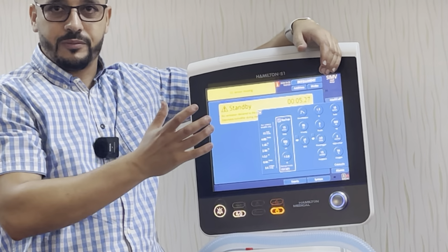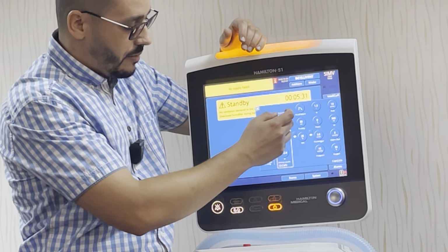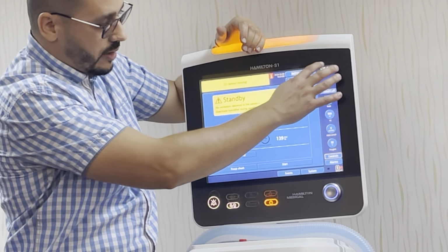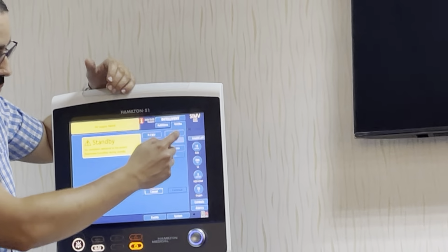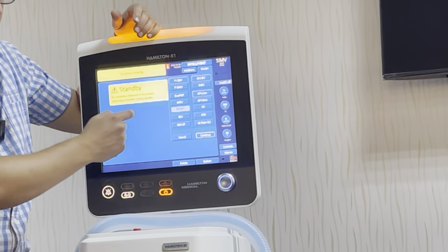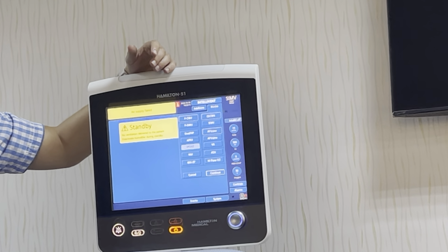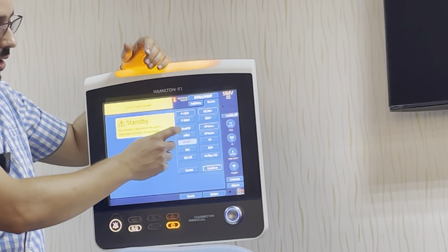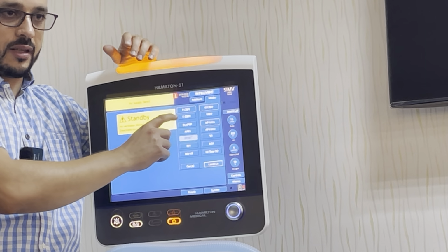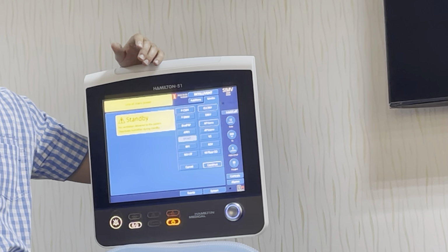اسماء المود يضيعوا. هذاك علاش تو المودز في يعني بعد نكملوا هذه على السريع. تو شفنا السي ام في وشفنا الاس اي ام في. في الباي ليفل مود اللي هما ديو باب والاي بي ار في، وعندنا سبونتينيوس اللي هو CPAP with pressure support. Okay. باب هذا الباي باب ولا لا؟ ديوباب والاي باي باب. والاي بي ار في واللي حكينا على بكري الاير واي بريشر ريليز فنتيليشن.